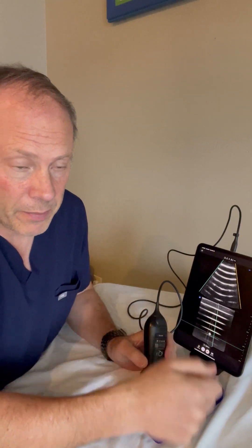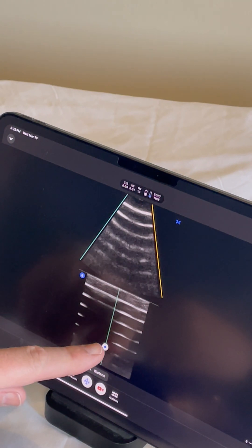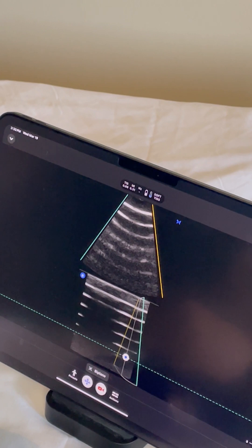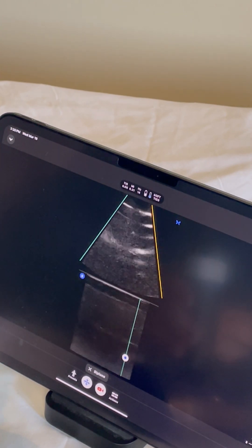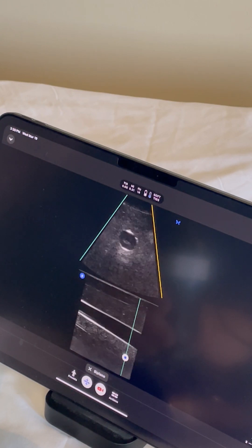Get yourself a big screen, because both of the images are only half the size, so trying to do this on a phone can be hard. In biplane mode, the top image is your short axis, and you can adjust exactly what plane you look at by sliding this little line right here. I like to put it all the way over to the right so that I will pick up the needle as soon as possible as I approach my target.